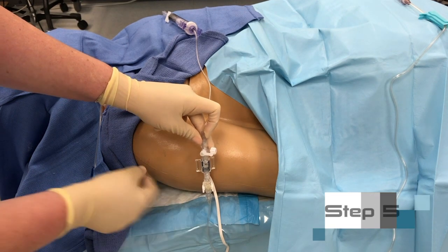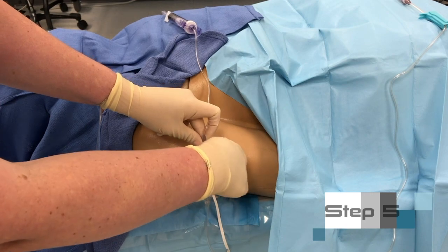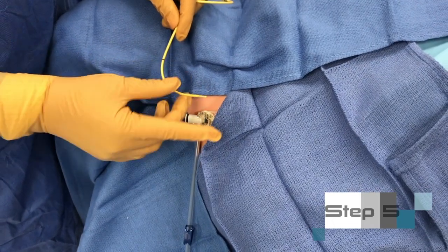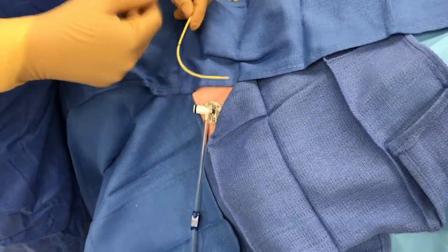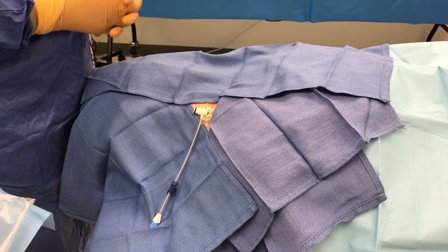Step 5. Have the assistant zero the transducer to the phlebostatic axis. Check the transducer function by gently tapping the end of the PA catheter. Step 6. Place patient in supine position. We are now ready to insert the PA catheter.